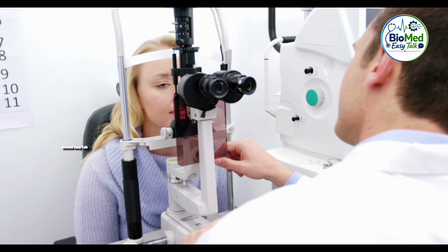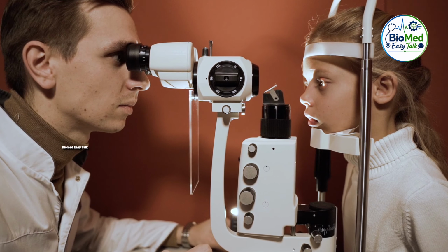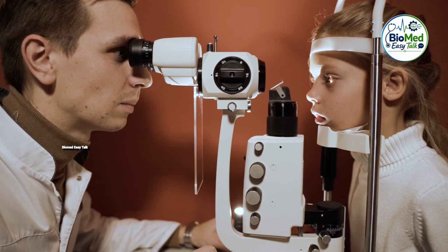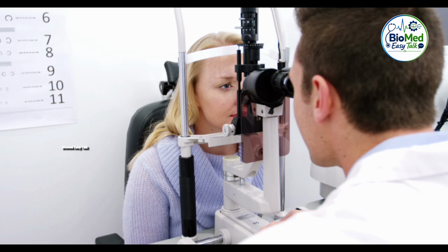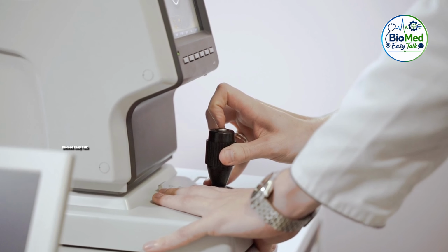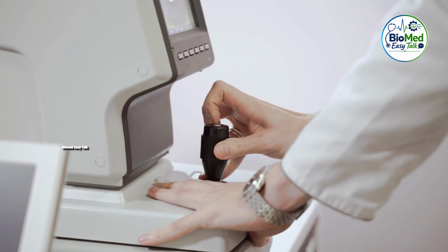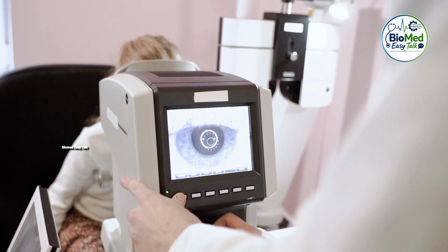Parts: light source produces bright light. Slit system forms a thin beam of light. Binocular microscope magnifies eyes in 3D. Objective lens focuses image. Eyepieces used to view image. Joystick moves instrument. Chin rest and headrest keeps head steady. Filters change light for examination.